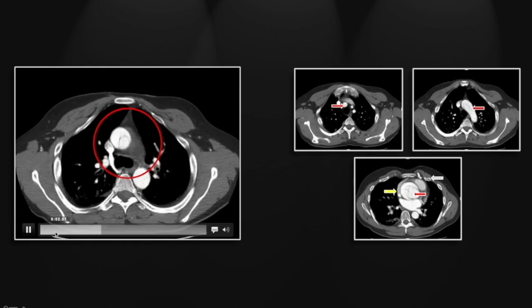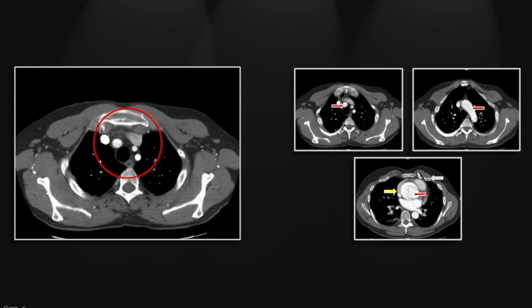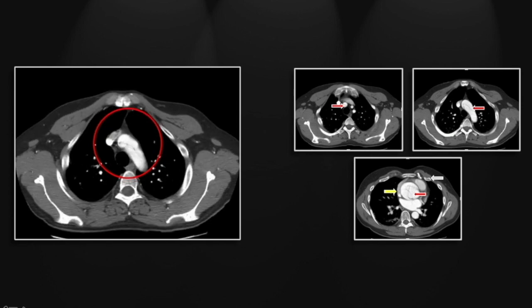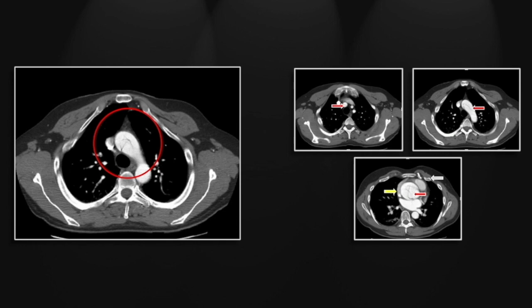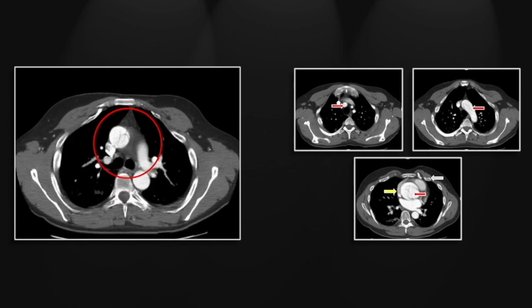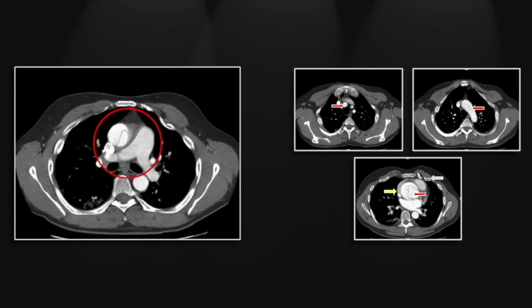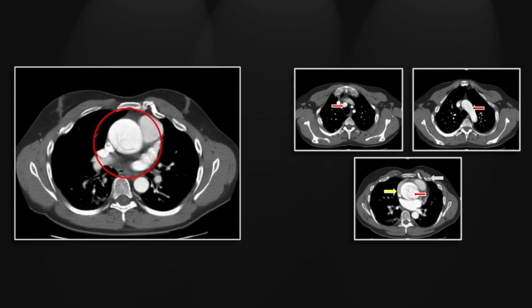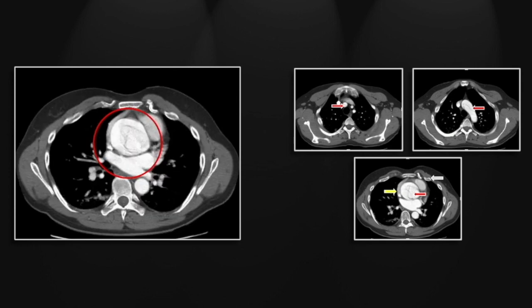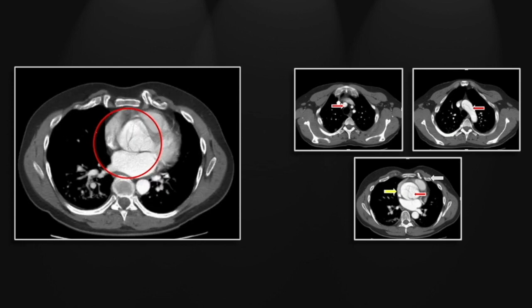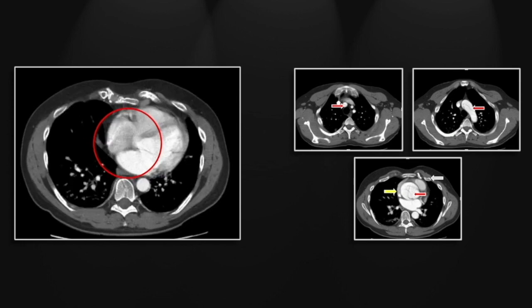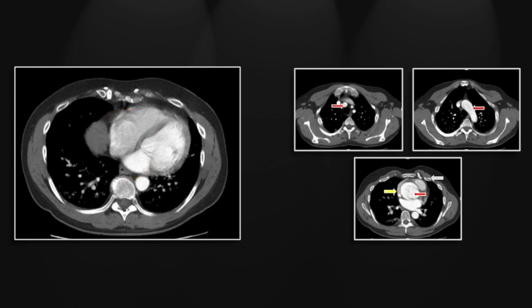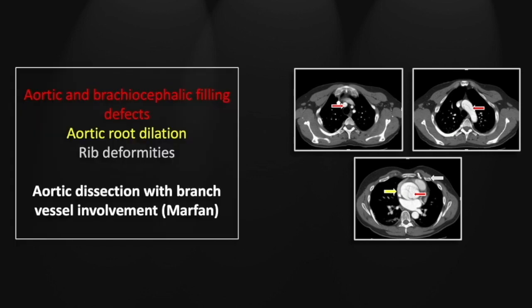There is a very nice example of the branch vessel involvement extending up into the great vessel origins and all the way down into the aortic root. The dilation is predominantly in the region of the aortic root and does not extend significantly up the ascending aorta. Note again that rib deformity, almost certainly associated with Marfan syndrome. So that is an aortic dissection with branch vessel involvement in Marfan syndrome.